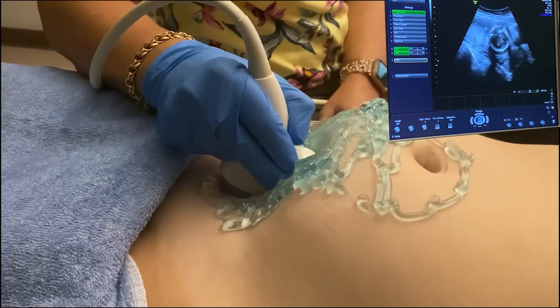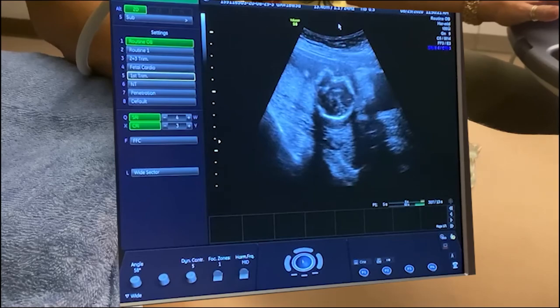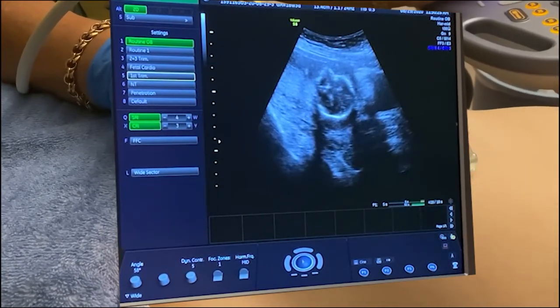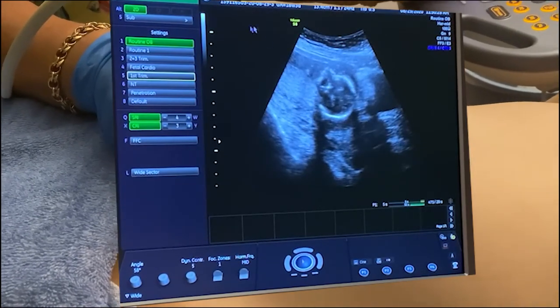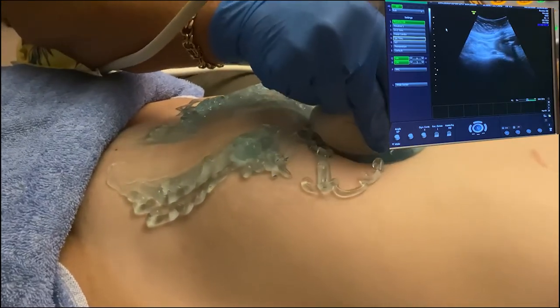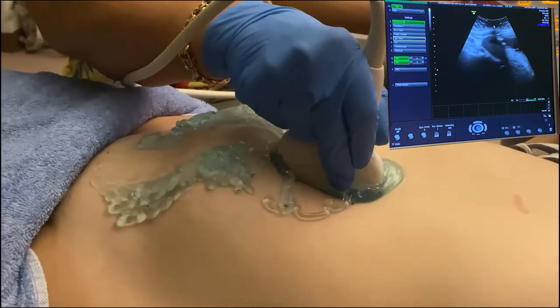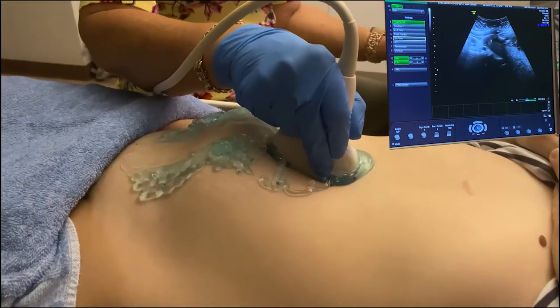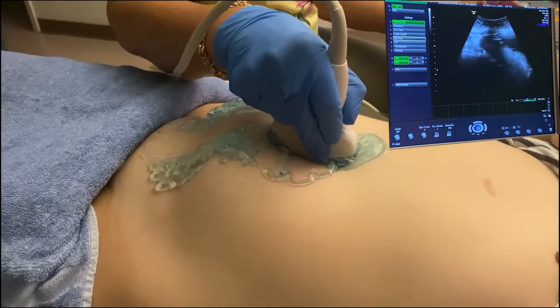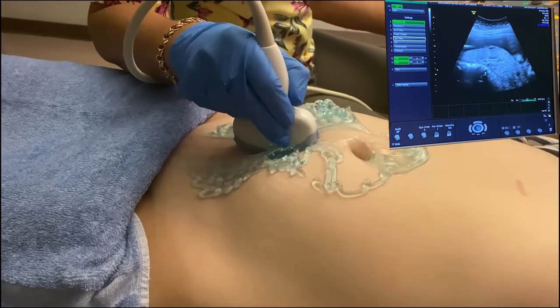So what we should see moving anterior. This is the patient's anterior abdomen. This is posterior. This is towards mom's head and towards mom's feet. So the top of the uterus is up here. We're just going to do a little survey. And as stated, this is patient's umbilicus. We can see as the shadowing through the belly button, and the uterus is just superior to that. This is the patient's aorta thumping, and we see baby's feet. So this is anterior uterus, posterior uterus.